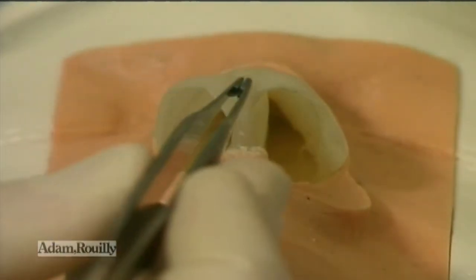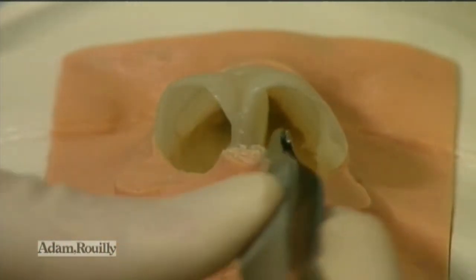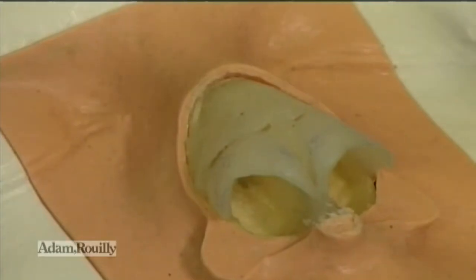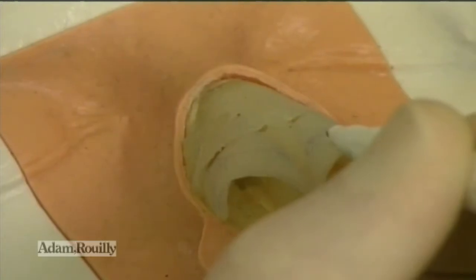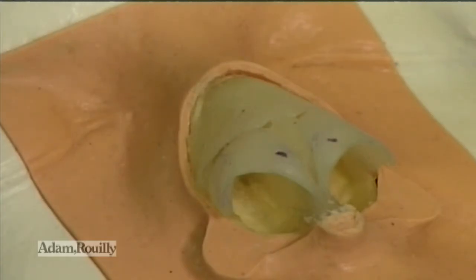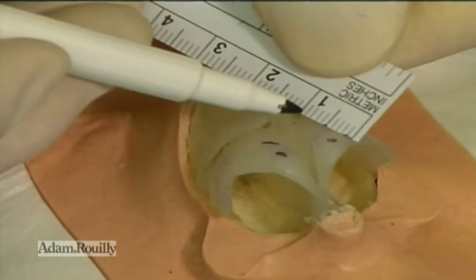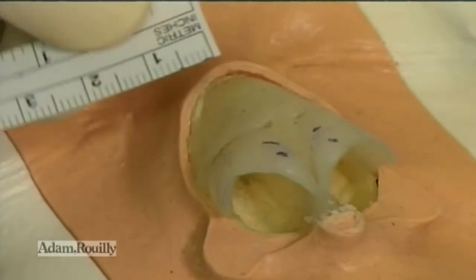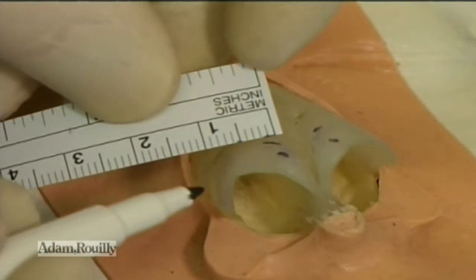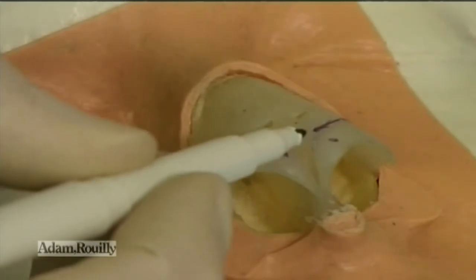The open approach shows an increased intercrural angle of greater than 30 degrees, and widened domes of greater than 4mm. In addition, the mid-septum deviates to the left. In performing an alar cephalic trim, we need to define and preserve the tip defining points. We need to preserve at least 6mm of the alar cartilage. We don't need to go further than 12mm laterally in this particular instance. We are going to take some of the intermediate crura as well, in order to bring the tip defining points together.